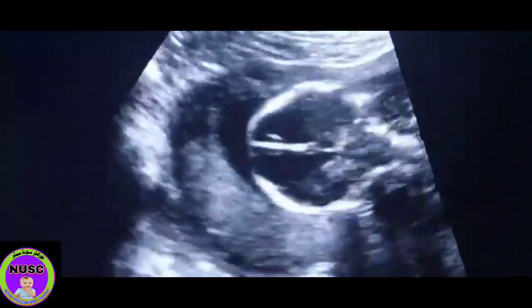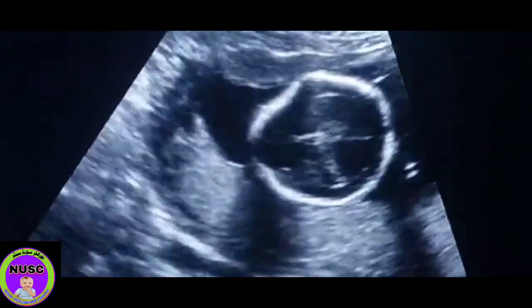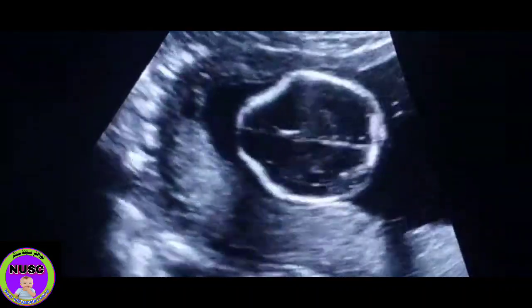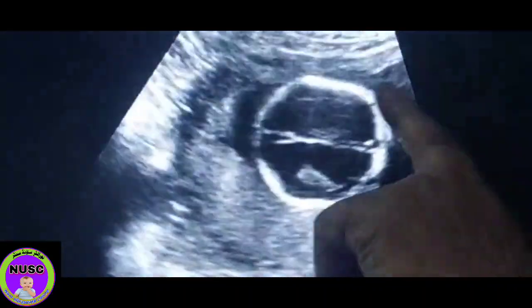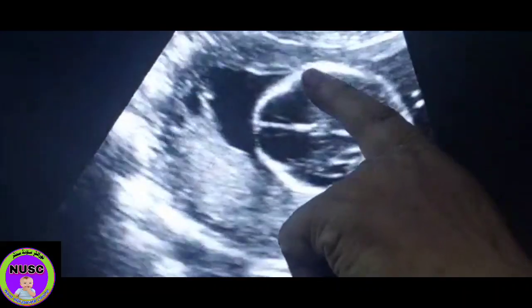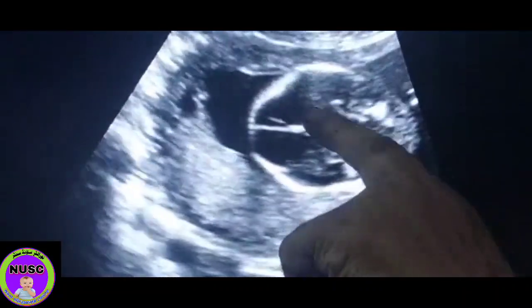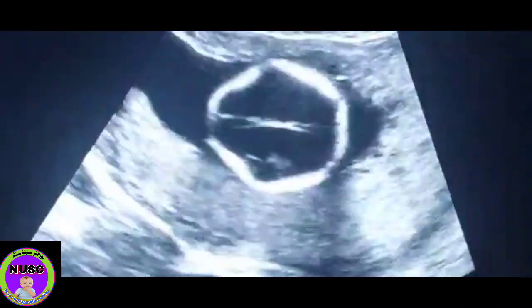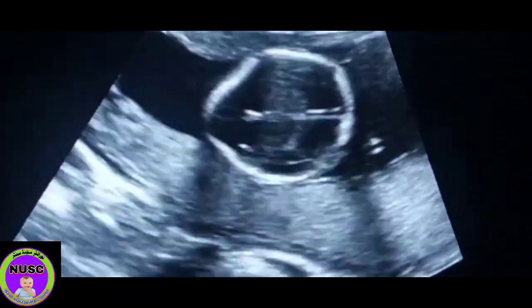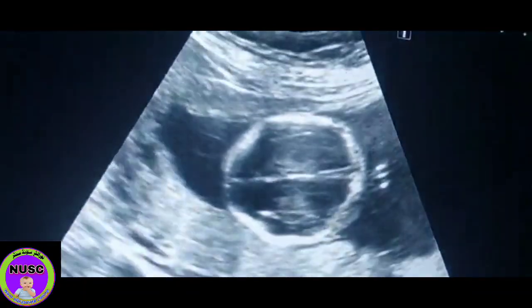Here you see, this is a case of obstetrical ultrasound. Here you see, this is the head of the fetus, with this frontal bossing. This head looks like a lemon — it is a lemon-shaped head.